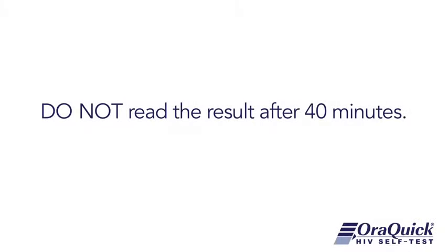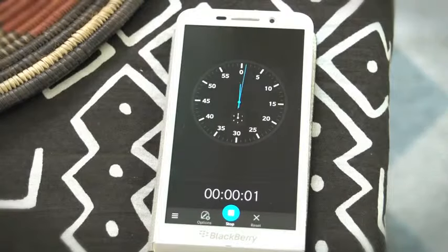Do not read the results after 40 minutes. Now, let's read the result.